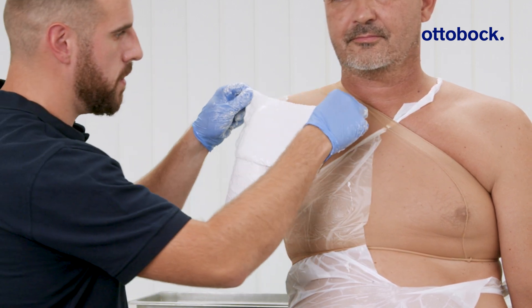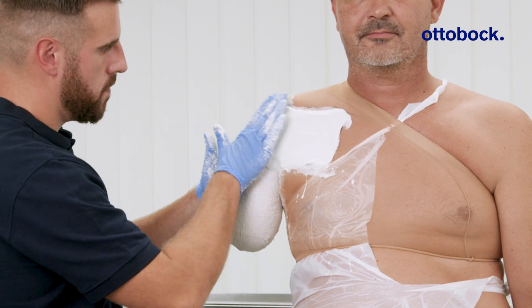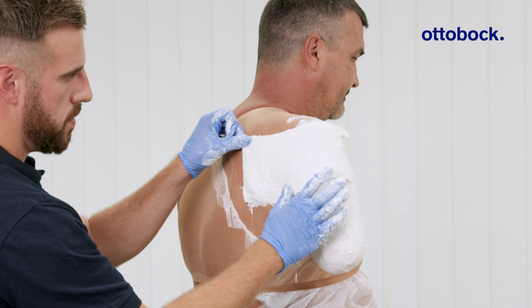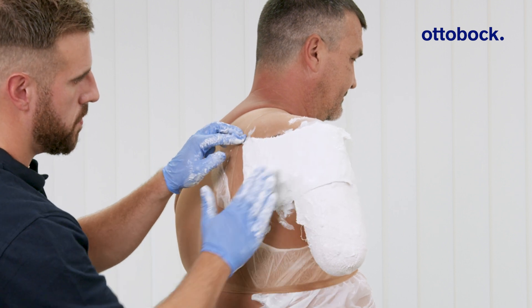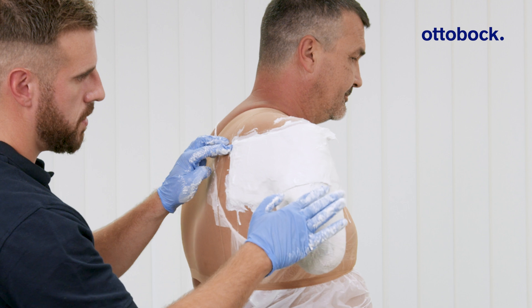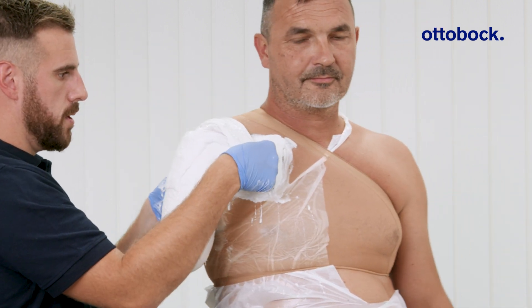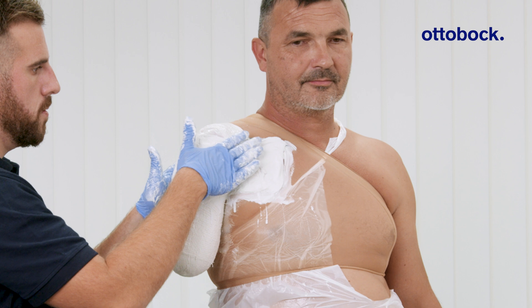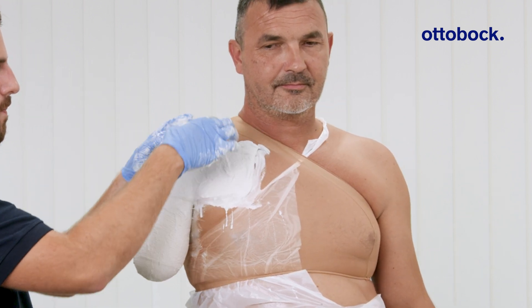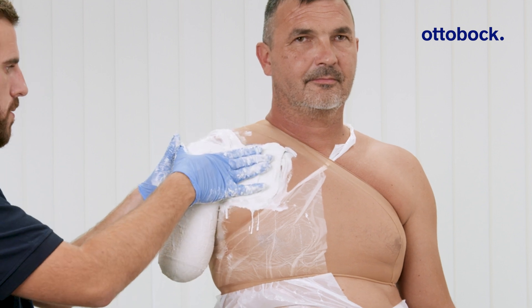Apply and shape both the anterior and posterior splints and connect them using the connecting strip. Use moderate, even pressure to create a proper fit and contour.